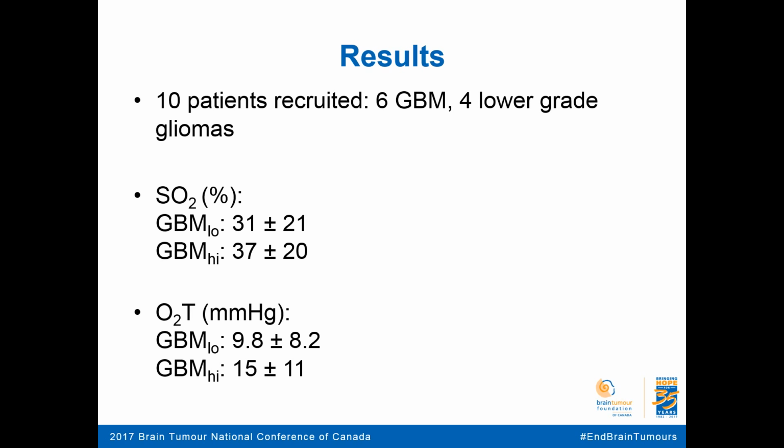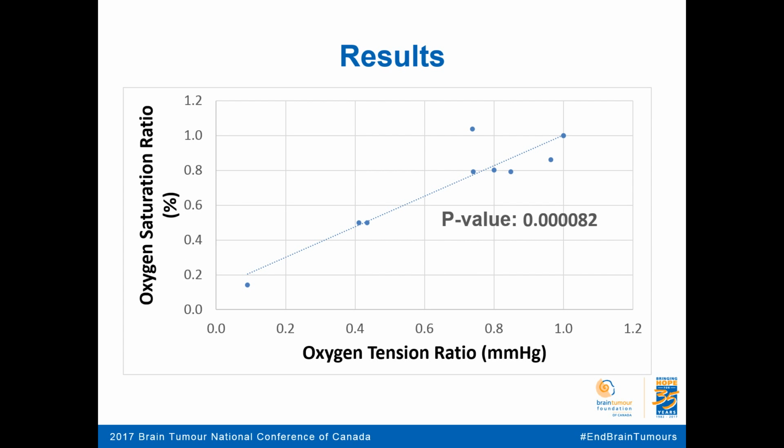But if in a single patient we use one tumor as a local environment, we can divide these numbers together to compensate for local effects of tumor in each case. And that's what we get. So if we divide high to low of the Lycox system, or probe system, to high to low of our MRI system, we have pretty good correlation in terms of what we see.